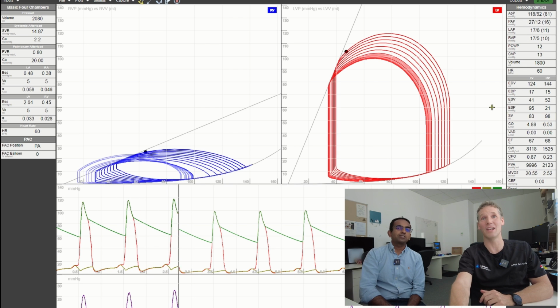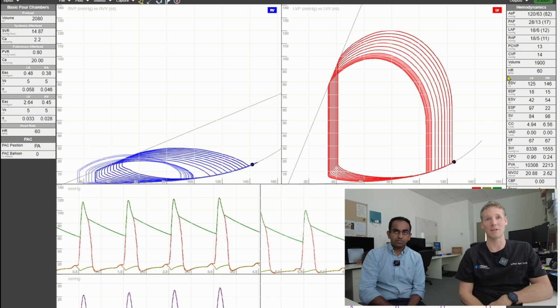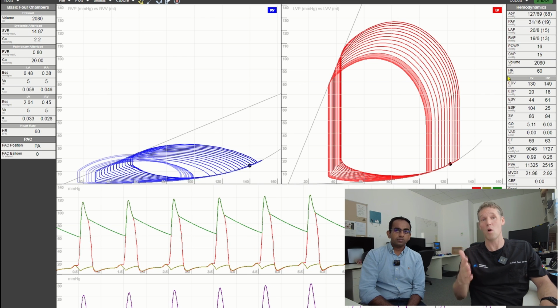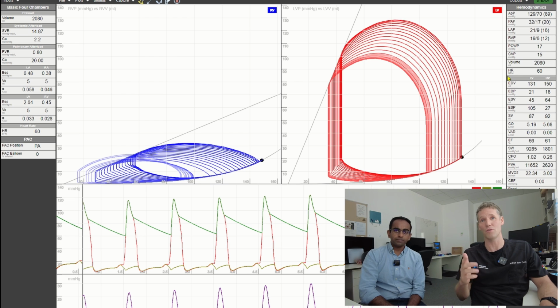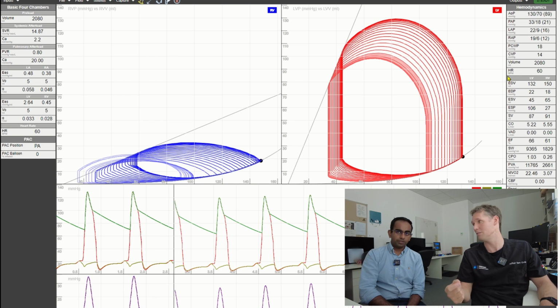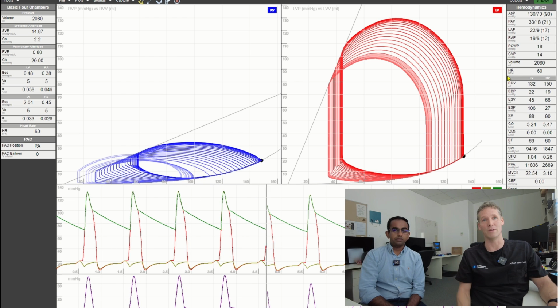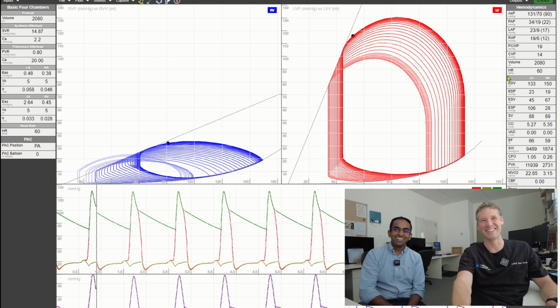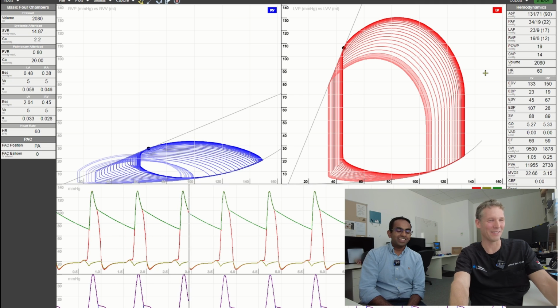And you can see that on the left ventricle hemodynamic loops as well. So I think this hopefully quite elegantly demonstrates why these patients need fluid, and this is not the same as someone who's got pulmonary hypertension, for example, and a blown out right ventricle, who's got worsening compliance. Yeah. And maybe we'll show that in another case. Yeah, this is really cool. I love it. I think that's pretty cool. Okay, let's have a look at the echo.